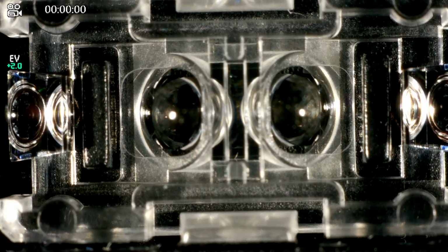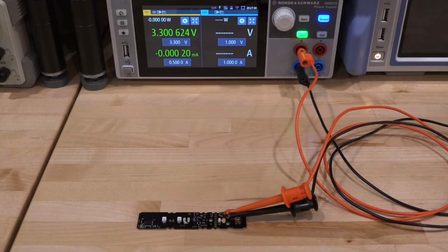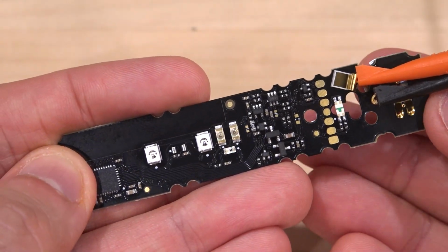I think we should turn it on and see if any of those LEDs light up at all and how much current it draws. And here it is connected to my Rohde & Schwarz power supply, 3.3 volts. It's basically drawing nothing. That negative number is basically the offset of the power supply that it has. So we're going to go ahead and try it, turn it on, and see if any of these LEDs flash. So let's see if I can turn this on using this metal piece here.